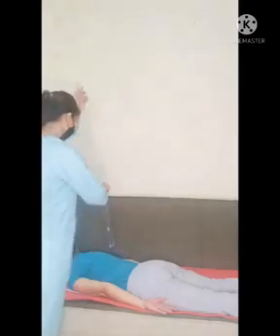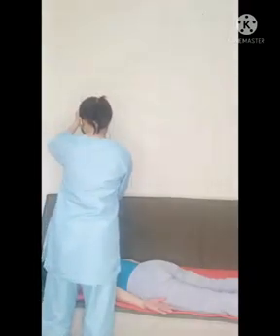So, our central ray in this projection is 15 degrees tube angulation toward the mid-sagittal plane, entering at the level of T2 and T3, 3 inches distal to the vertebral prominence and 1 to 2 inches lateral to the mid-sagittal plane. The structure shown in this projection is the slightly oblique sternoclavicular joint.